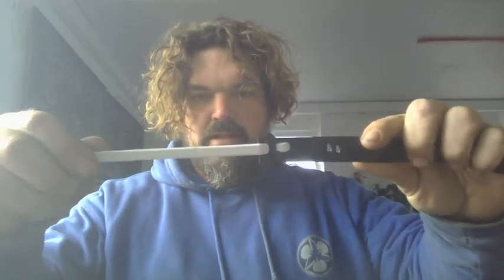So, you start like this. You go like this. So, that's the inside. You go on the other side. So, the back of the head you need to leave it slack because what you want is that the screen is away from your face. So, first it covers you better and it's also better to distribute the moisture of your breath even behind a mask. So, it's easy.